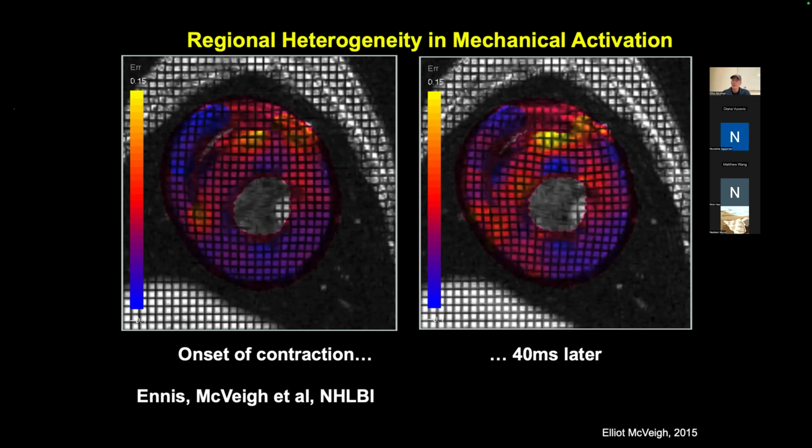But anyway, what they showed was that preceding all of the metabolic and blood tests for whether or not you were having graft versus host disease, the strain actually changed first, right?